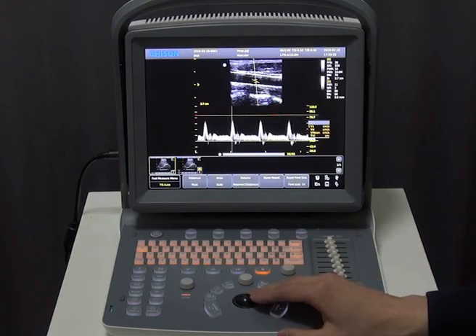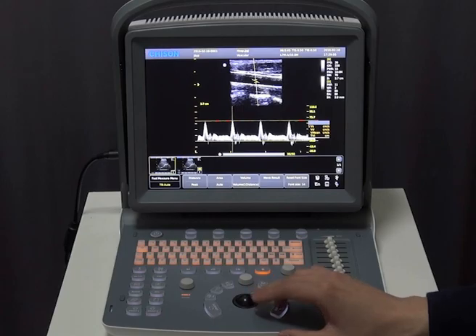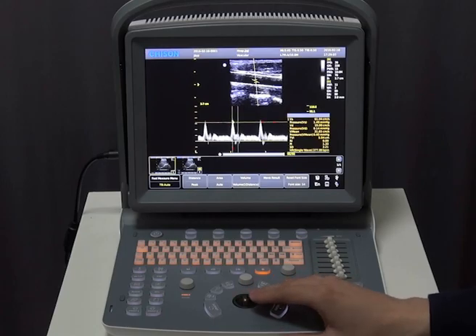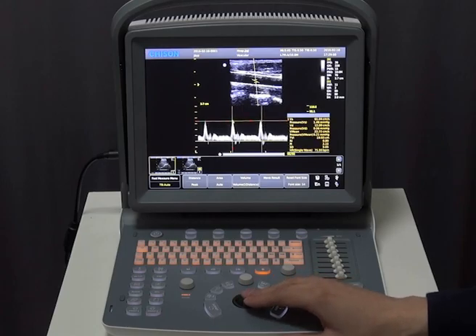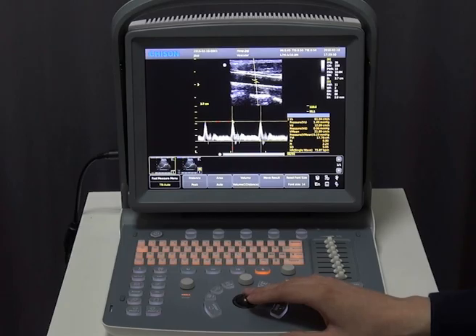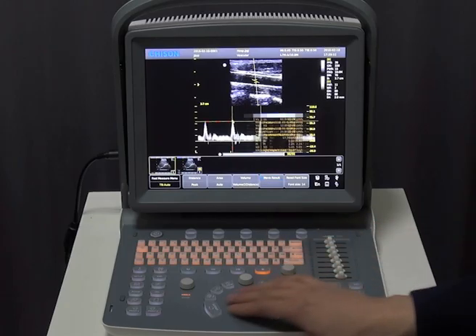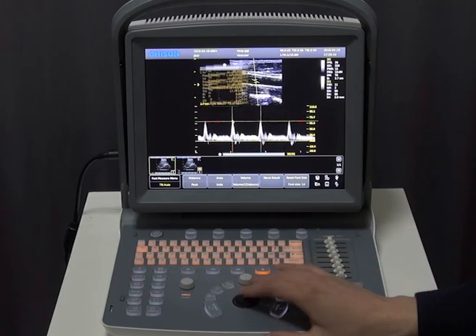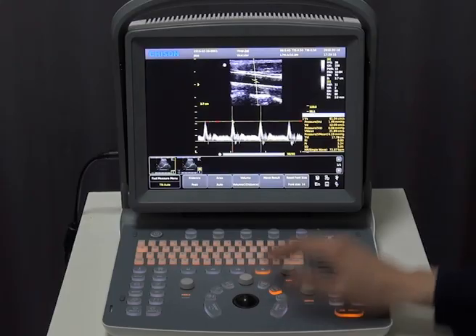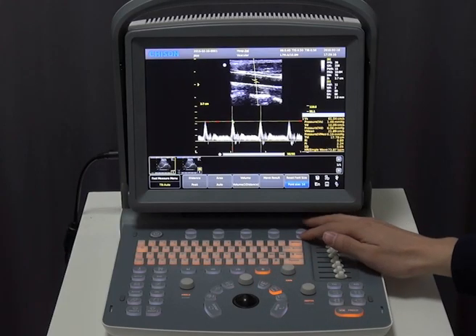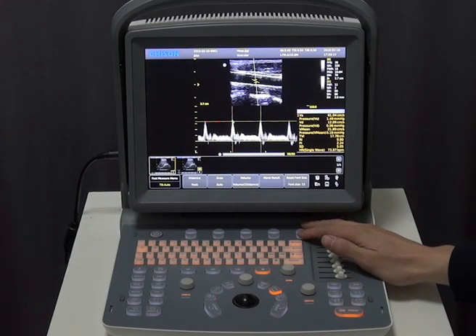After we get the spectrum, we can press Trace to envelope all the spectrum. Then you can choose one circle or two circles, and click Enter. You will see the spectrum result on the screen.